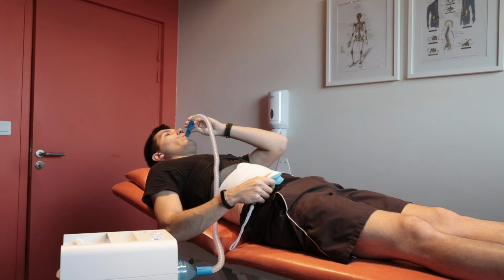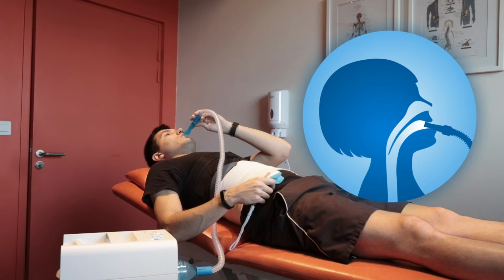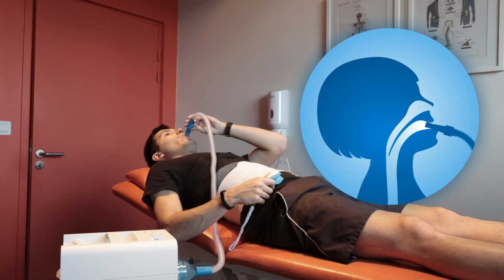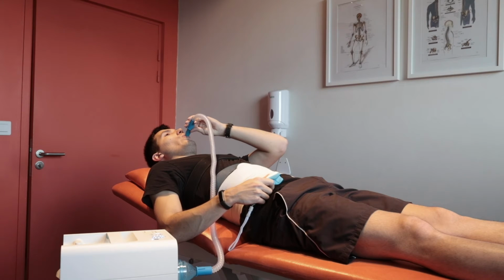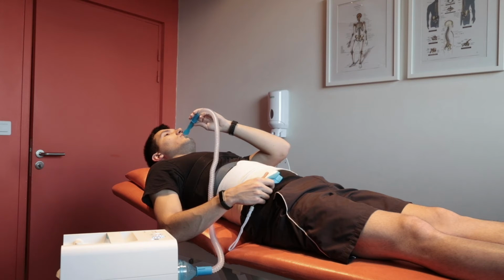The mouthpiece is placed in the mouth like a trachea extender, keeping the glottis open. It must be placed on the patient's tongue and maintained between the teeth. The patient holds the tip with the left hand and the device controller with the right hand, if right-handed. Perform the first sessions at low power. Gradually increase the power when the patient has learned how to use the device and is able to diffuse the vibration in the bronchial tree.